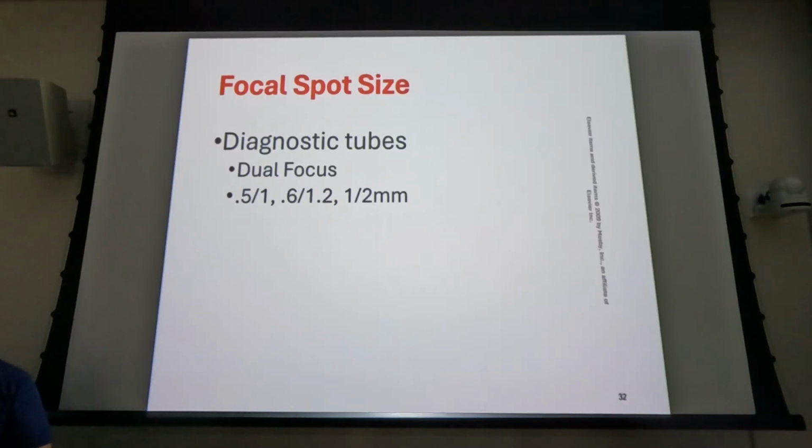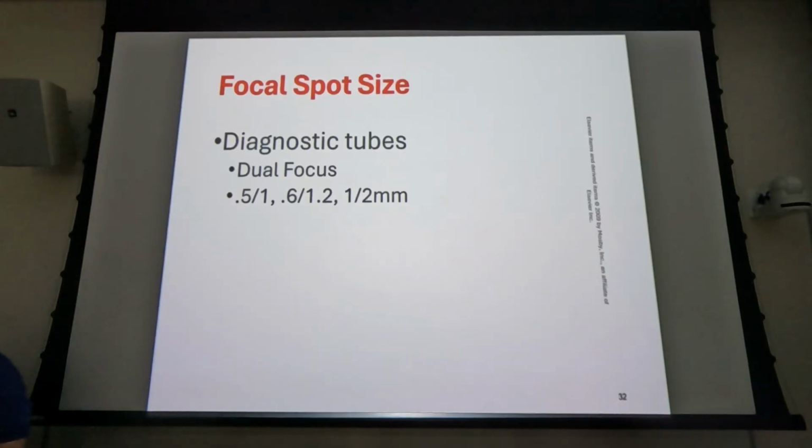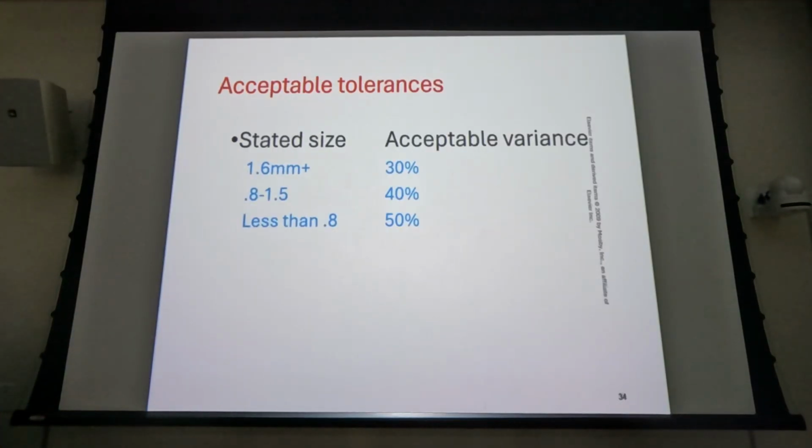So what's the difference in that? In one, you get an exposure. In the other, you don't get any exposure, right? So your answer is, should be identical, should be the same. Large and small focal spot exposure should be the same, as long as the machine allows you to make that exposure. Large, small focal spot. Okay.